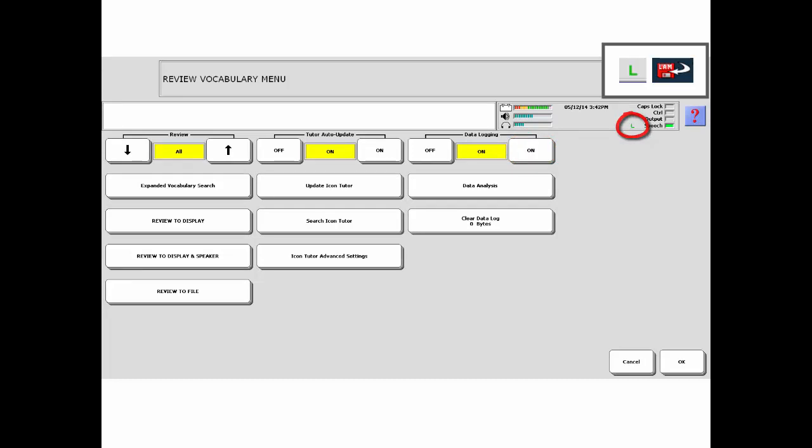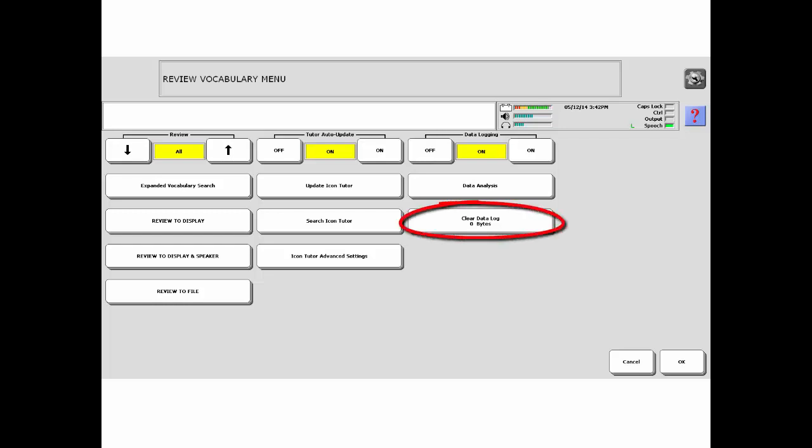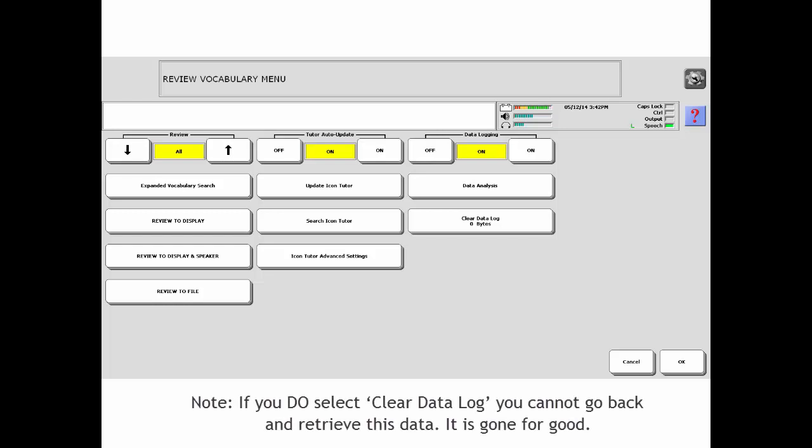From this menu, you can also see how many bytes of data are collected. In this example, I can tell I am starting with a blank slate because there are zero bytes of data collected. If you see a number here other than zero, that means you have already collected some data. You can either keep it and add to it or clear it out if you are not interested in looking at it.